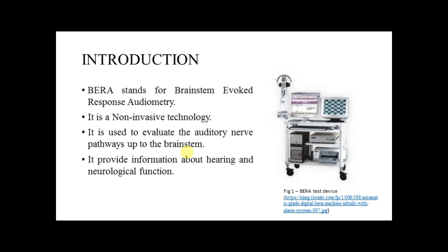BERA stands for brainstem evoked response audiometry. It is a non-invasive technology which is used for measuring the auditory signals from the ear to the brain. It is used to evaluate the auditory nerve pathways up to the brainstem. This evaluation allows us to understand how the auditory signal reaches our brain within the auditory pathway. It provides information about hearing and neurological function.